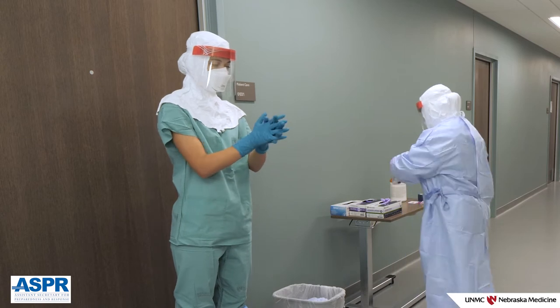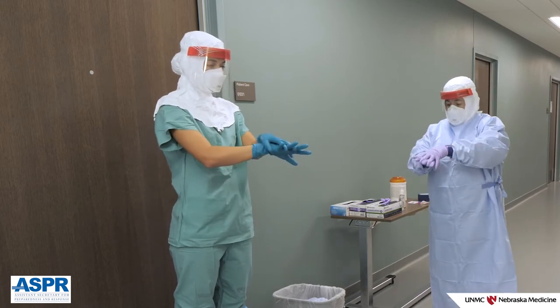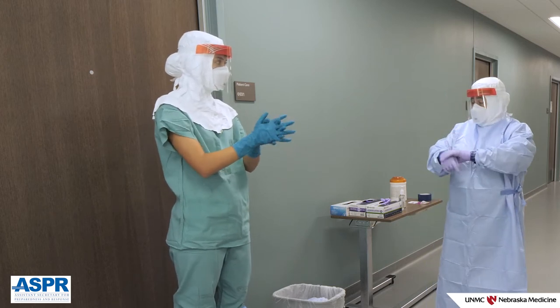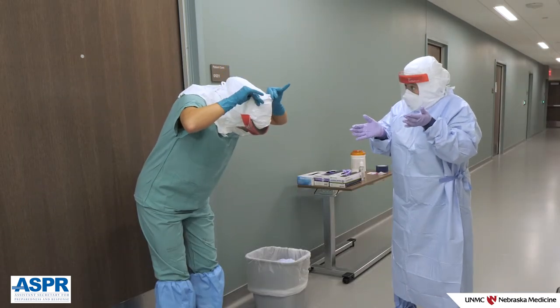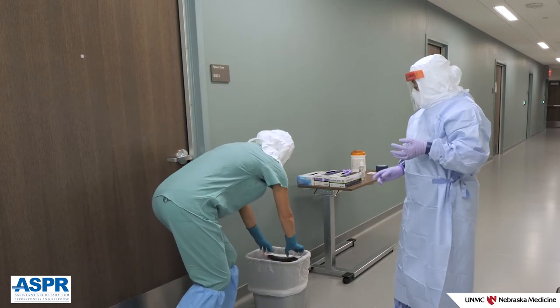Perform glove hygiene on the remaining layer of gloves. If the final layer of gloves is removed with the base layer, perform hand hygiene and don new gloves. Next, remove the face shield by pulling the strap over your head from behind. Place the shield face down into the waste container.